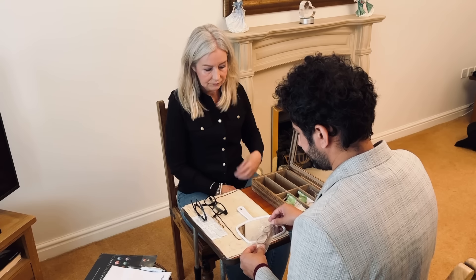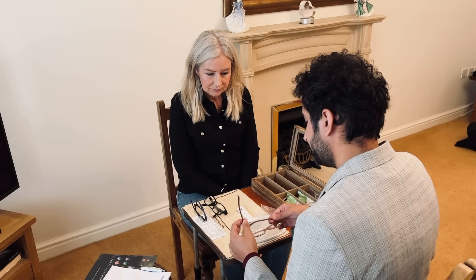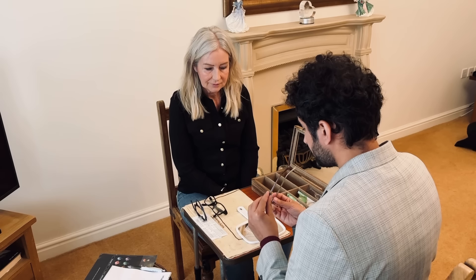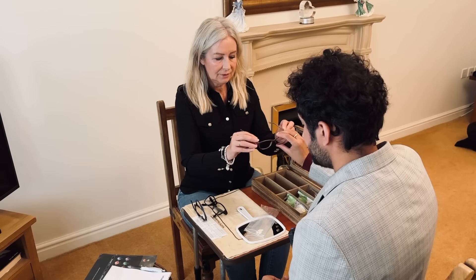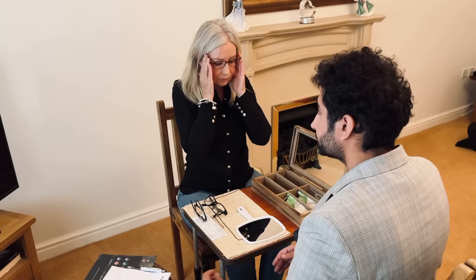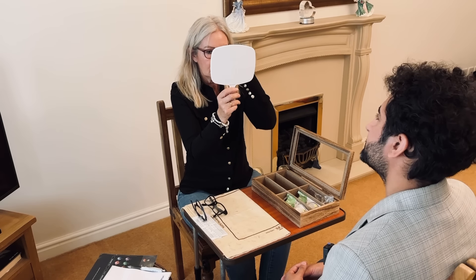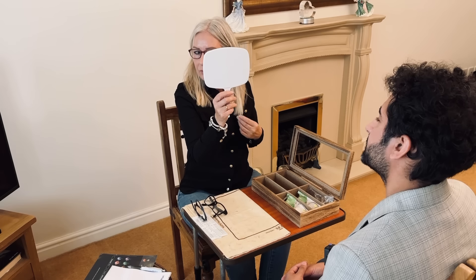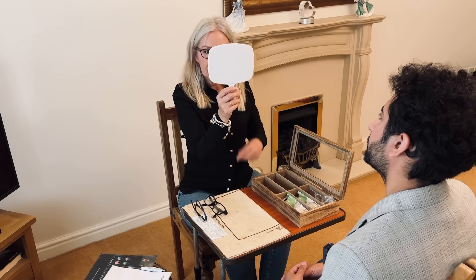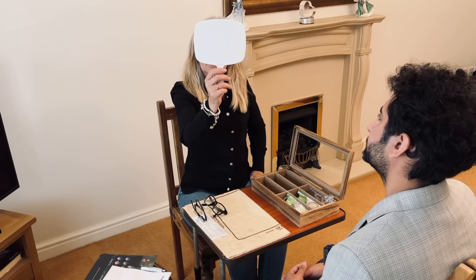Okay, now we're going to a different area with the colours, really. It's a little bit lighter — sort of a brown and yellow, two-tone. Bigger lens, deeper lens than the first pair at least. Have a look. I like them. They go well with blonde hair. Yeah, I like those as well. Because you've never really considered a lighter frame before, have you? You've always gone for dark ones. Nice size as well — you've got enough coverage there for reading and computer. I like that one as well.